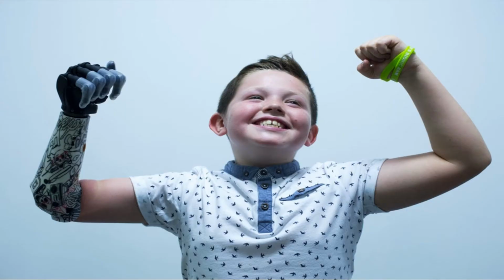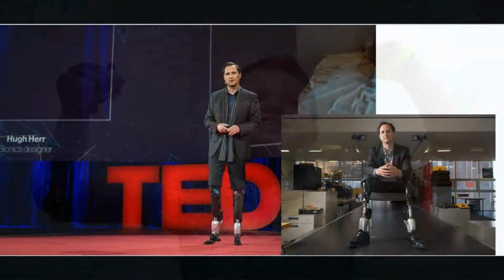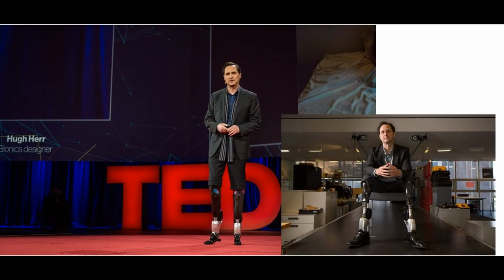Despite the lengths we have reached in developing cutting-edge prosthesis, the technology still remains broken. We are a ways off from being able to capture the exact biomimetics that govern our biological limbs, but current research is promising. For instance, Hugh Herr at the MIT Media Lab was able to develop the first ever bionic limbs that can function on neural command. The subject merely has to think about moving the biological limb in order to control it. This provides added control of the prosthetic as well as restores the self-confidence of its user.